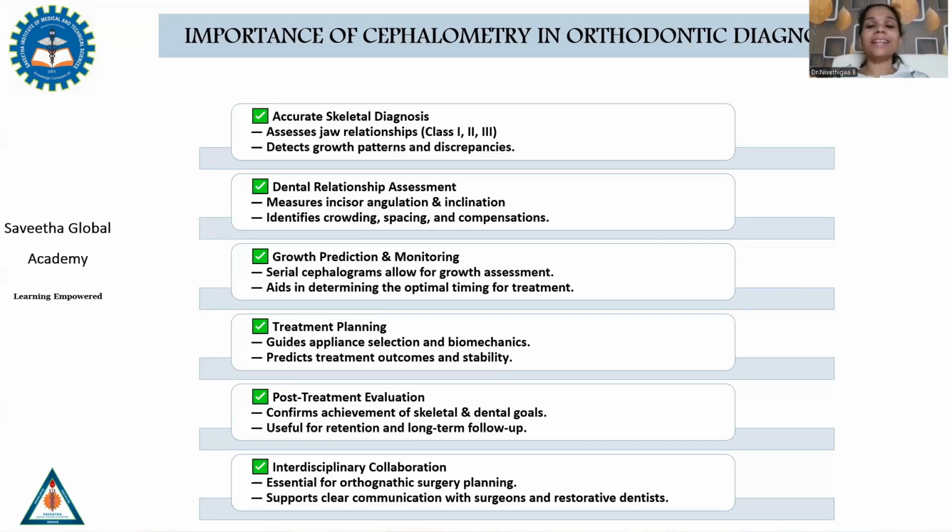It helps in dental relationship assessment. It helps in measuring the incisor inclination, angulation, identifying the crowding, spacing and other compensations that are present within the arches. It helps in identifying the growth prediction and monitoring by taking serial radiographs.